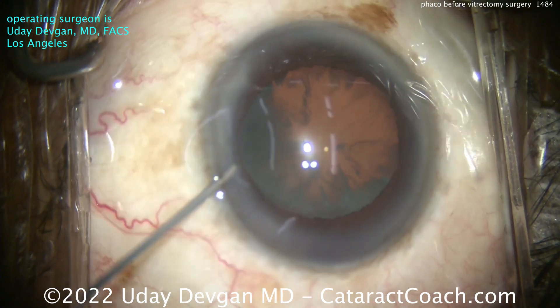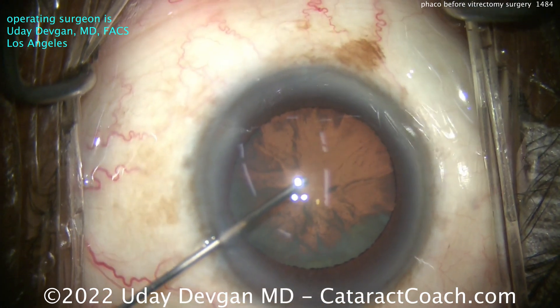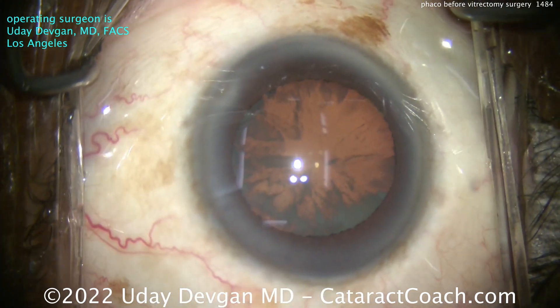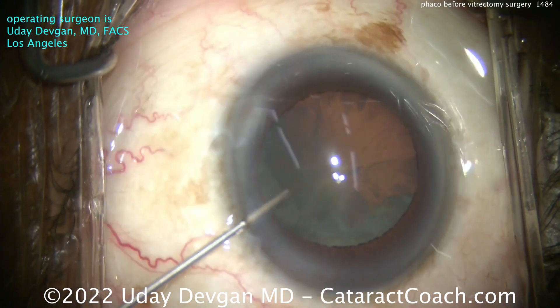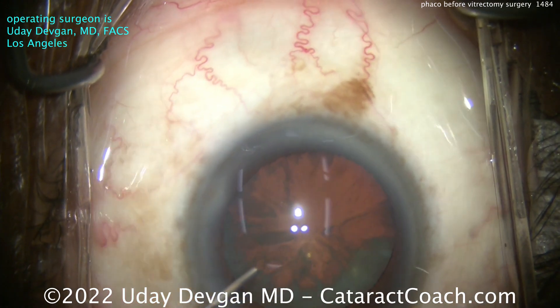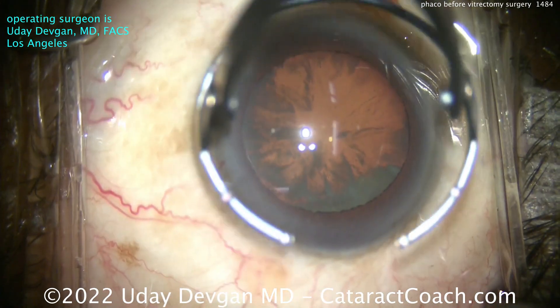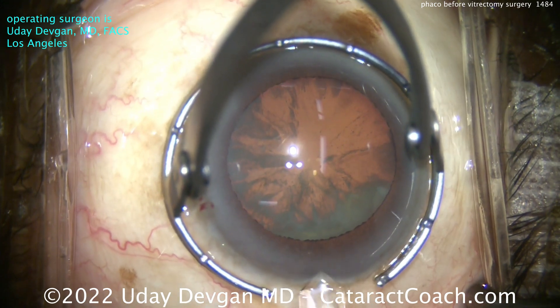This patient has a cataract, and you can see it's providing a pretty poor view of the posterior segment. The patient also has a full thickness macular hole that's going to need to be repaired. So the vitrectomy surgeon requests that you first fix the cataract and put a monofocal lens in so that the view for performing the vitrectomy and membrane peel is a lot better. This is quite the compromised view because of the cataract, especially the cortical spokes that encroach on that central part of the lens.